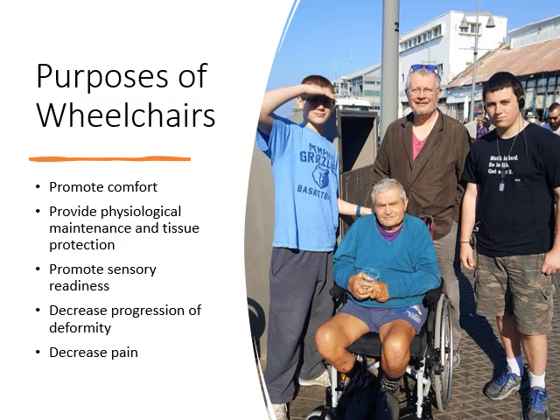Aside from promoting comfort and making sure that the person is protected from further injuries or deformities, the wheelchair has a functional orientation. So we need to consider the user's needs and goals. Primarily, we're going to consider the user and the family, whatever their goals are, for how they need to use the wheelchair as part of an overall functional mobility system.